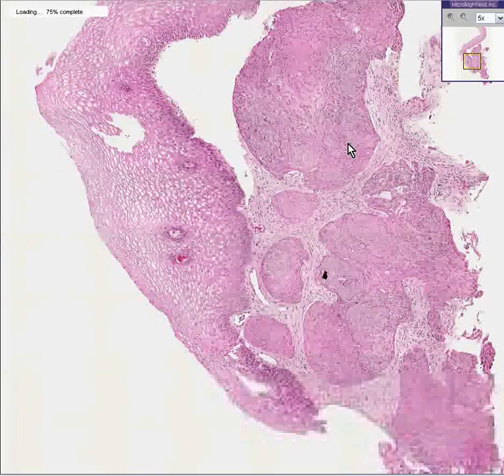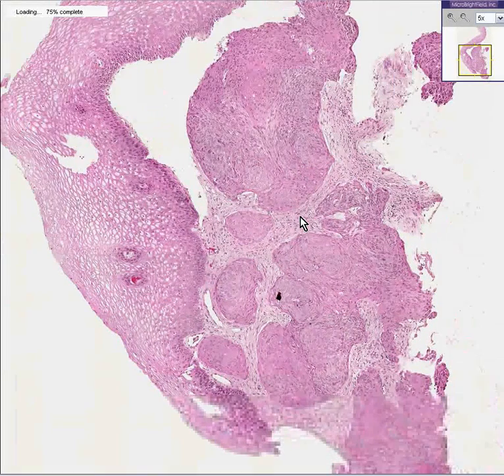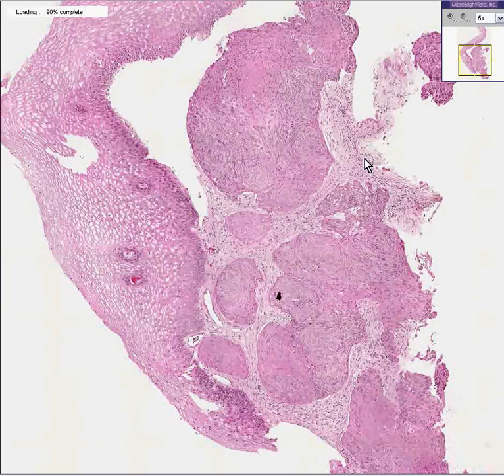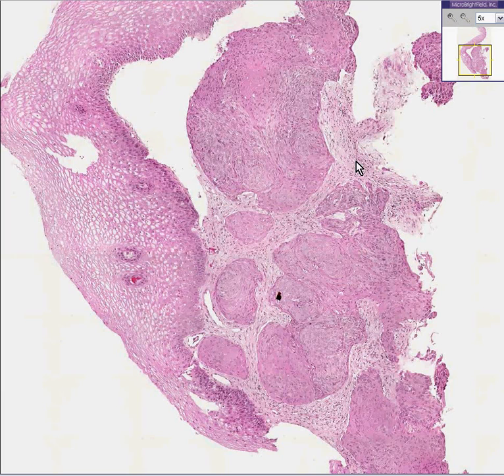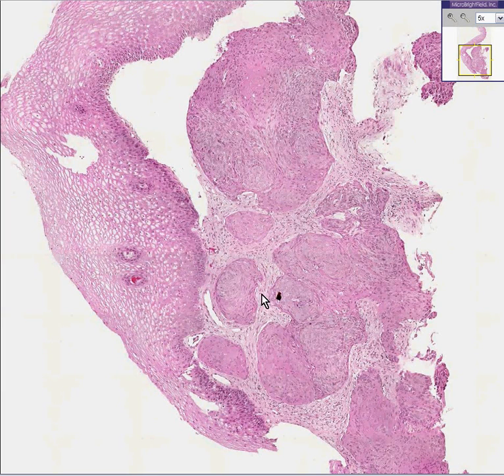First of all, there are no normal columnar or glandular epithelial structures in the underlying tissue. That's number one. Often with squamous metaplasia, you could see these squamous cells replacing some of them, or maybe some of them are still there.